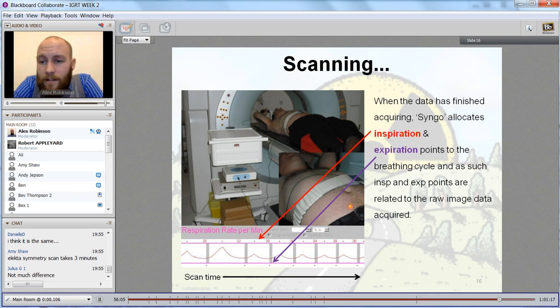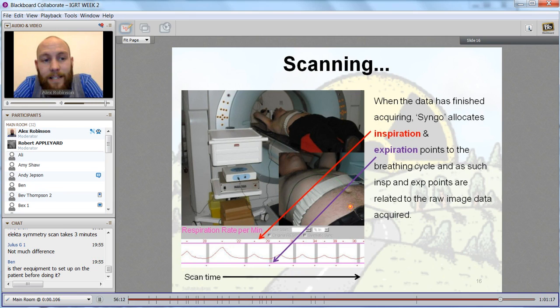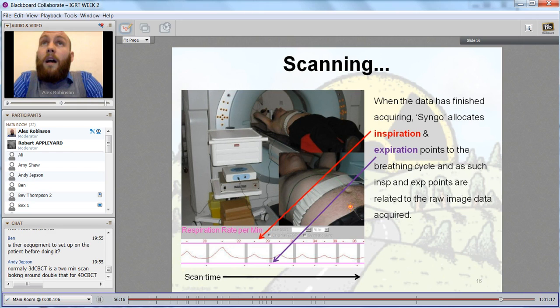Okay, so the benefits of having a fiance who's still a radiographer. She's just said that it generally takes 3 times longer doing a 4D CT, 3 minutes, exactly what Amy said, rather than 1 minute. So there is longer time, and obviously we'd have to consider, if we're truly going to look at this, dose once again. Can we justify giving the patient normal integral dose more through a 4D CBCT?